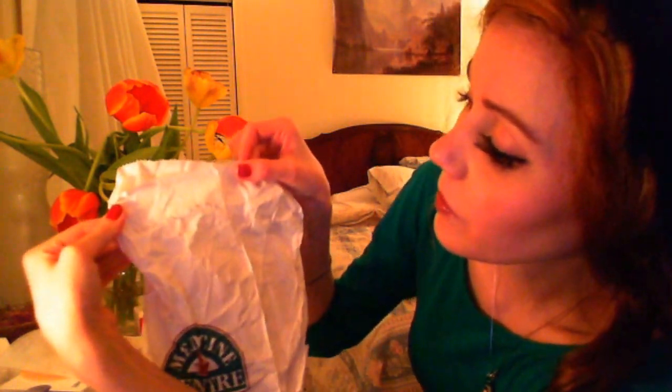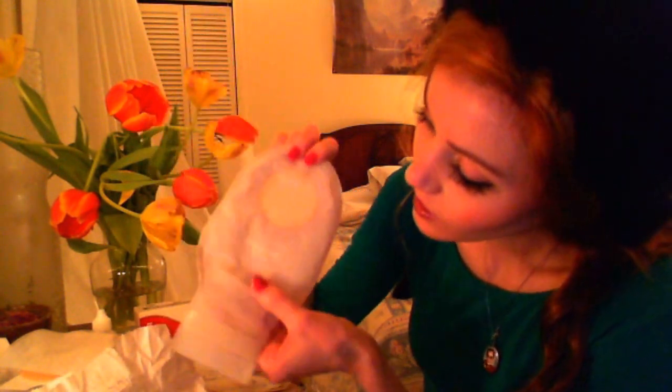There's another kind that is Hollister 3796, and these look like... these are also tiny. And they also have a Velcro attachment. It's quite handy. I do love a Velcro attachment. They're so cute. They're like little candies.